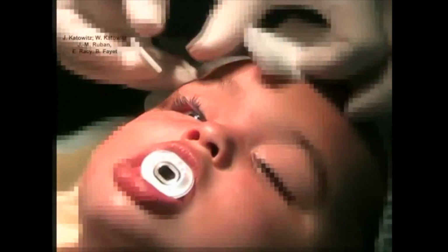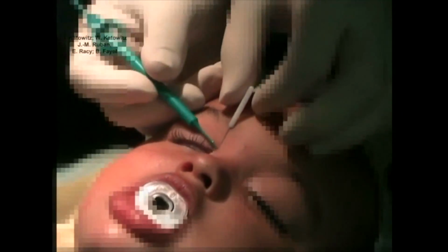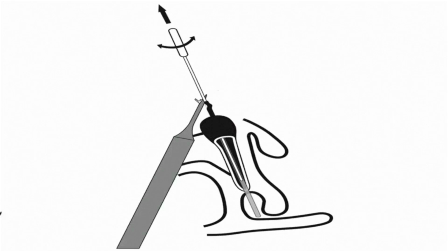The superior lacrimal punctum is preferred and should be gently dilated. The MASTERKA should follow the same pathway as the measuring device or probe used for the diagnostic probing. It should be possible to pass through most mucosal nasolacrimal stenoses in the nasolacrimal duct and the valve of Hasner, and then, just a few millimeters further, reach the floor of the nasal antrum.